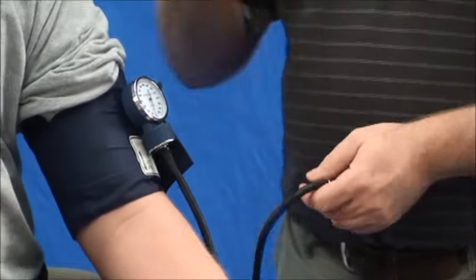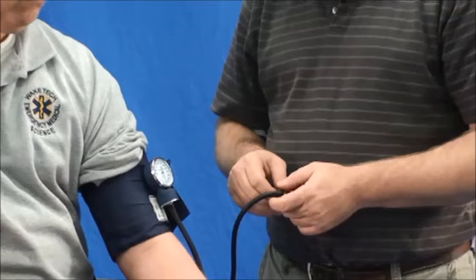This is only going to give me the top number or the systolic. And the way you'll represent this on your documentation is to put whatever number the systolic is. We'll say 120 over a P to indicate this is by palpation.